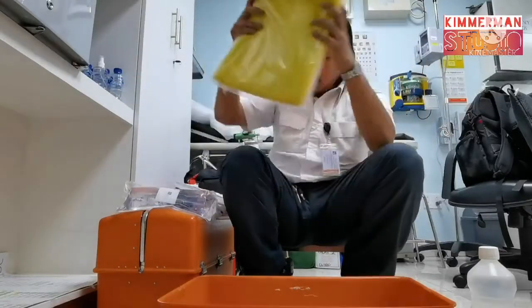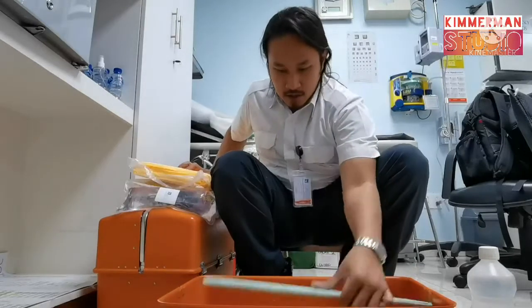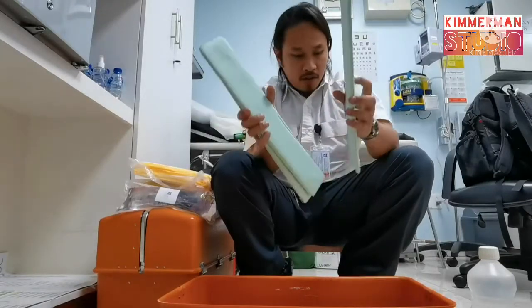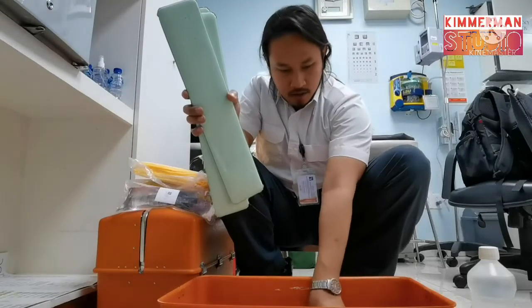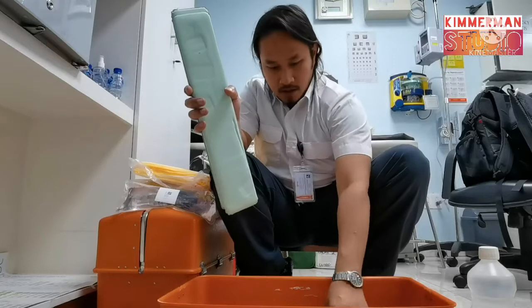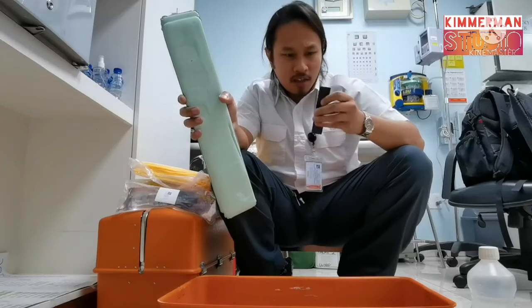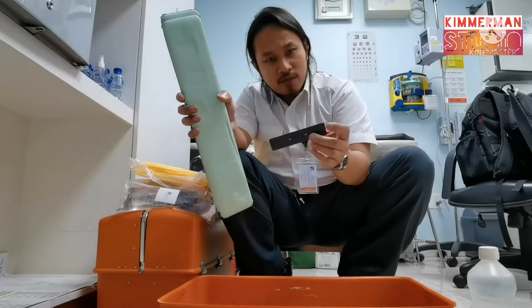Okay. And you also have here splints. Padded splints. And I think the finger splints also.